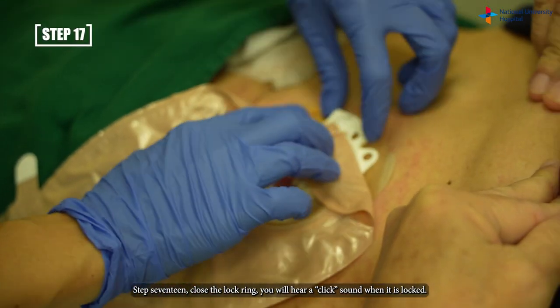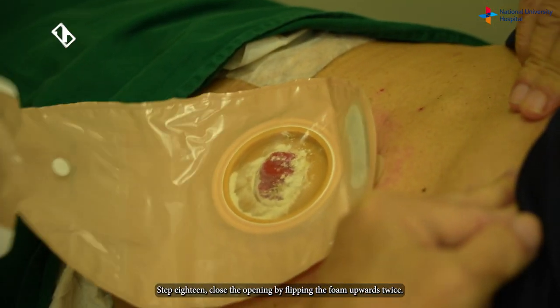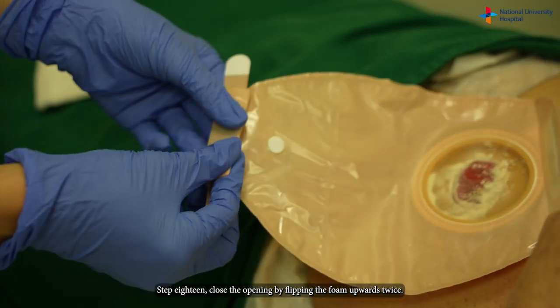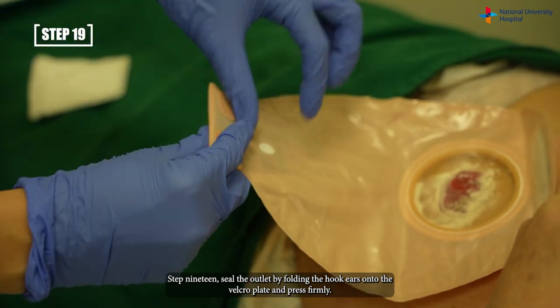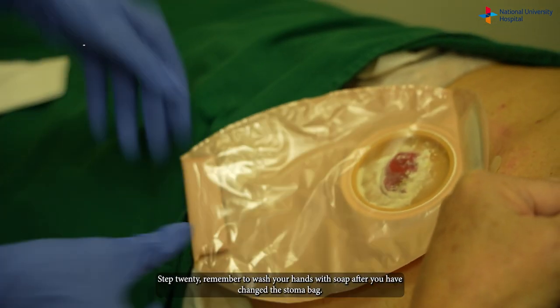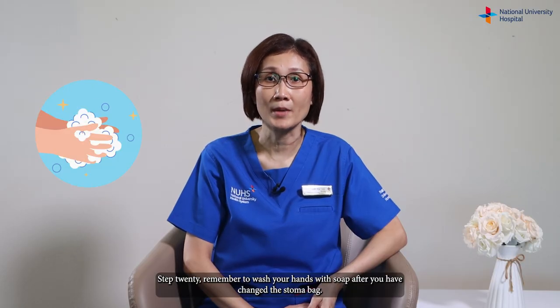Step seventeen: close the lock ring. You will hear a click sound when it is locked. Step eighteen: close the opening by flipping the foam upwards twice. Step nineteen: seal the outlet by folding the hook ears onto the velcro plate and press firmly. Step twenty: remember to wash your hands with soap after you have changed the stoma bag.